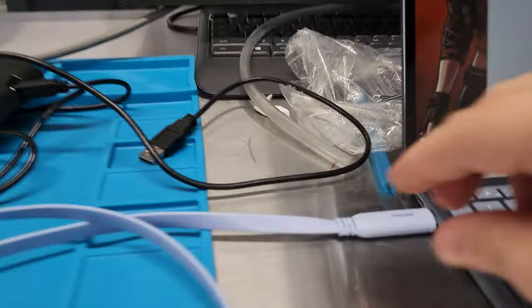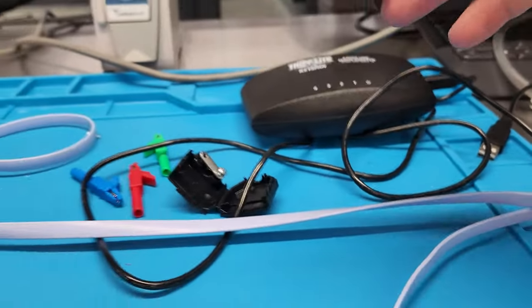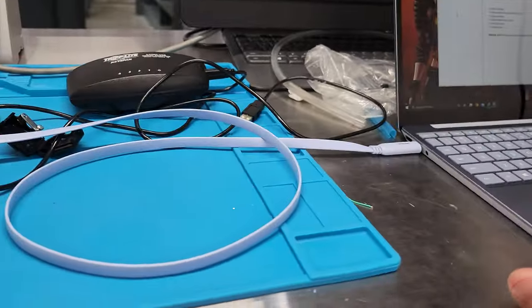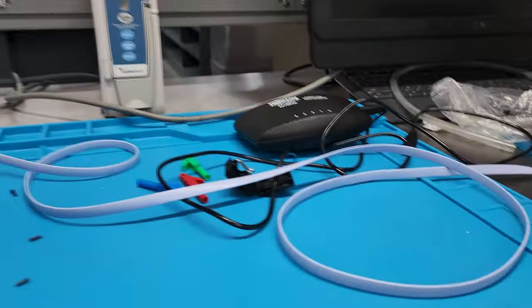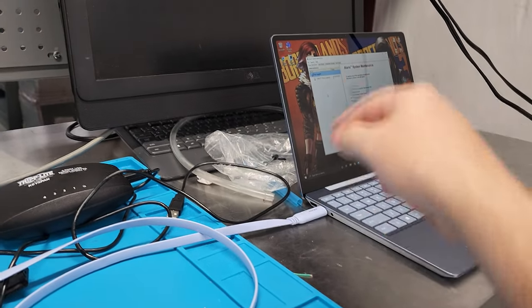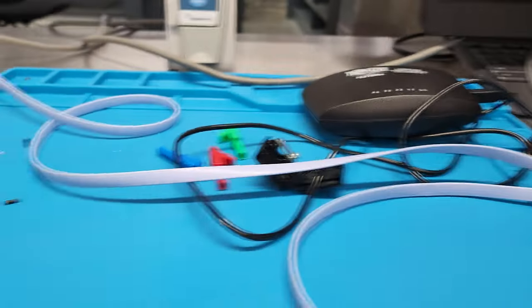Take a look at the size of this cable. Compared to how cumbersome the other one is, this little flexible cable is all we need to talk between a modern-day laptop or a cell phone to your pump. Because it's USB-C, we can connect this to a cell phone.